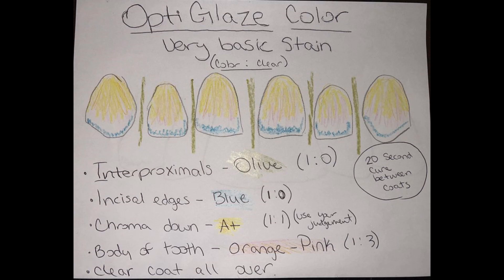If you do want to put any extra stain on the teeth, this is the very basic stain chart that I use. I usually do chroma down in A1 — so add some A1 on the gingival half, add a little blue on the incisals for translucency, super diluted pink-orange all over to just bring down the chroma a tiny bit, and then some olive in between the teeth because that creates a little separation. A super thin line of olive — nothing heavy — but we just don't want to give it that all-over washed-out look. A little bit of separation and some colorization, plus a little blue on the incisals, really makes them look that much more real and less like fake denture teeth.